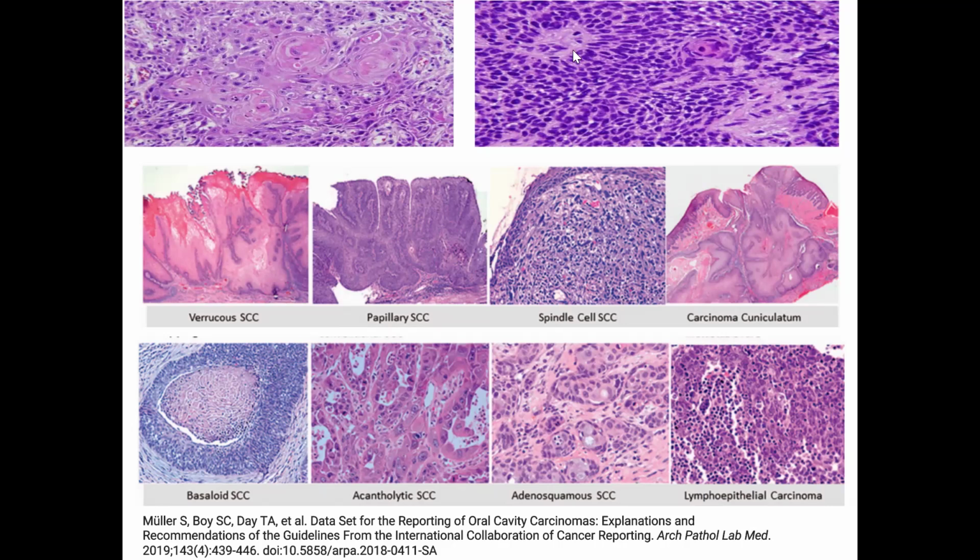And then just for reference, in the upper right corner is non-keratinizing squamous cell carcinoma. In non-keratinizing, you can still see maybe a little bit of keratin formation, but most of the cells will not contain that eosinophilic cytoplasm, and it resembles more so the tonsillar crypt epithelium and not stratified squamous epithelium. And we'll go over this as well.